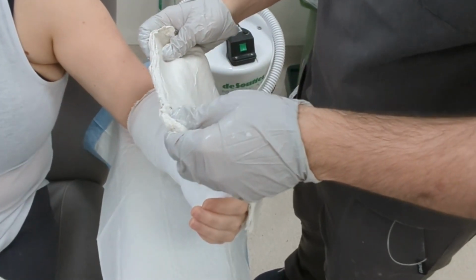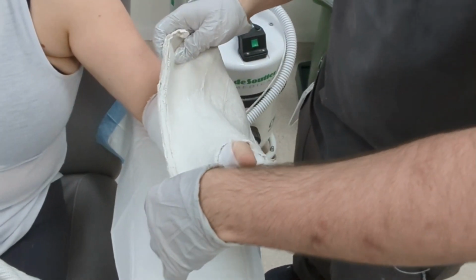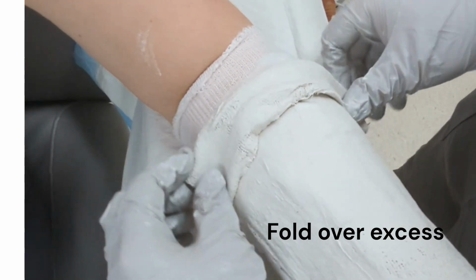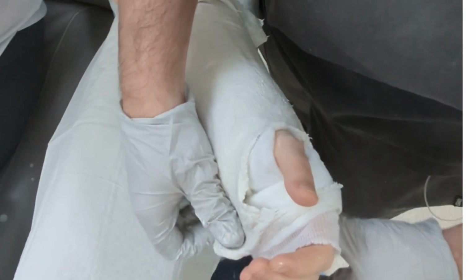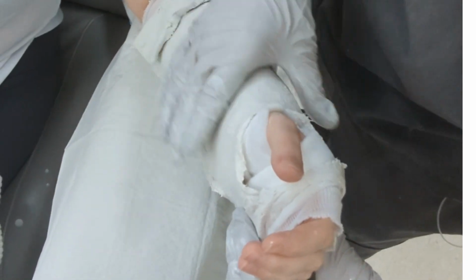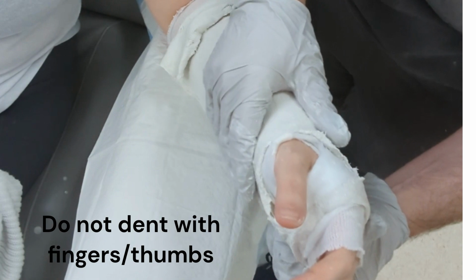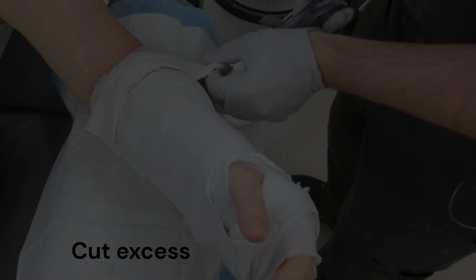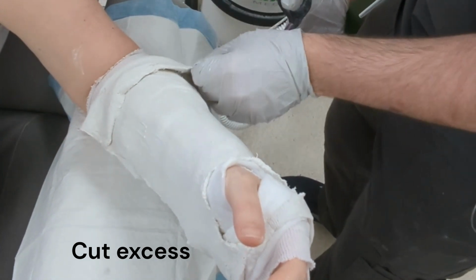Apply the cast carefully onto the soft band over the thumb. Any excess cast can be folded back and cut later. Ensure that there's an adequate length for the fingers and thumb, and when smoothing it out, do not dent it with your fingers or thumbs. While the cast is wet, the excess cast can be simply cut off.